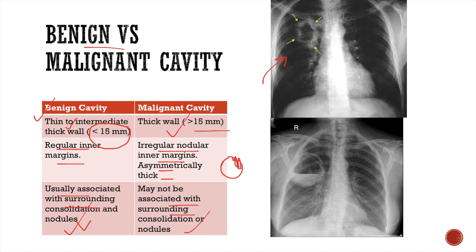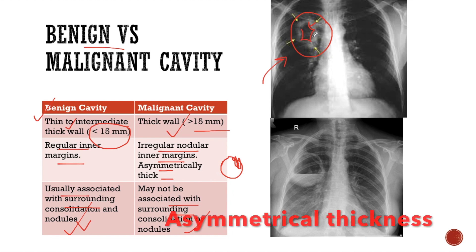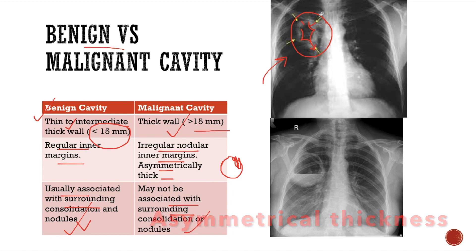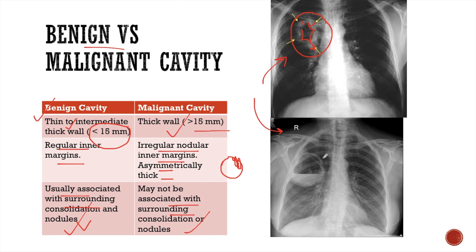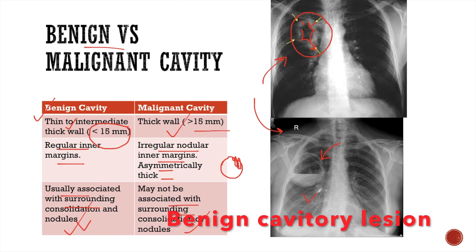In this first X-ray, we can see a lucent area in the right upper and middle zone. This lucent lesion has a thick wall, and the wall is nodular with asymmetrical thickness — it is more thick on the lower aspect and less thick on the upper aspect. So this is a case of a malignant cavity lesion. In the second X-ray, however, the wall of the cavity is thin and regular in appearance, with no nodularity. Hence, this is a benign cavity lesion.